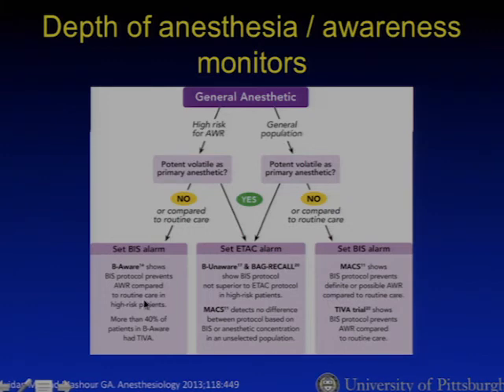And in the B-Aware trial, a significant portion of patients were receiving TIVA. So in patients who are not able to be monitored with end-tidal anesthetic gas concentration, it probably is prudent, and there is some evidence that a BIS protocol coupled with audible alarms, which is key, prevents possible awareness with recall.